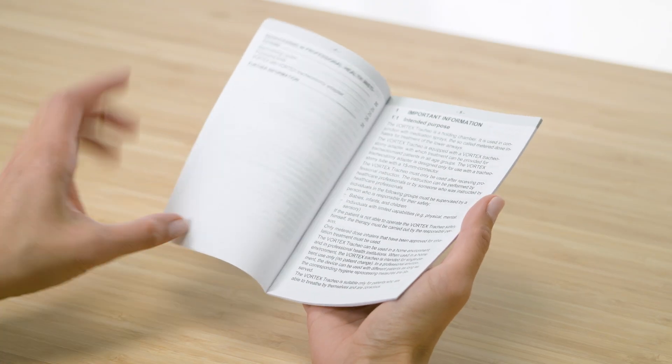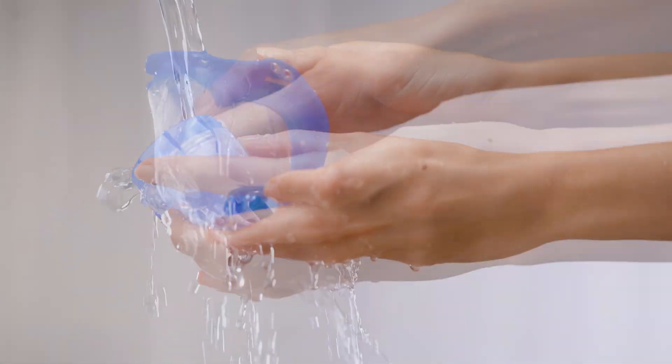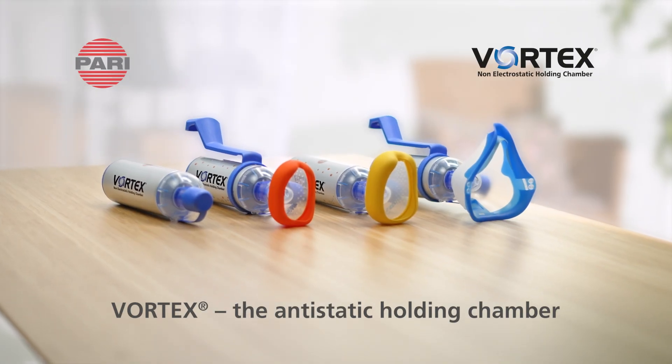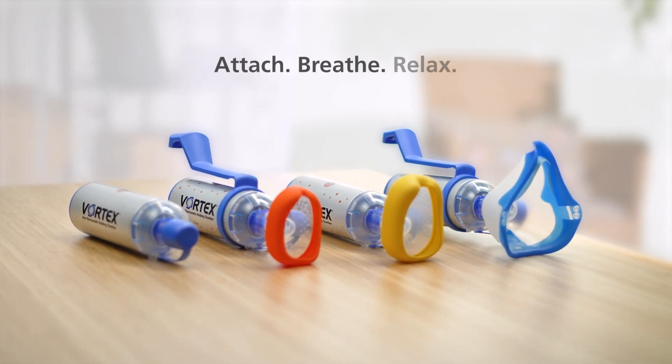Please always observe the instructions for use when using the Vortex. Information on cleaning is available in our cleaning video. Vortex, the anti-static holding chamber, so that the active substance reaches where it's needed.